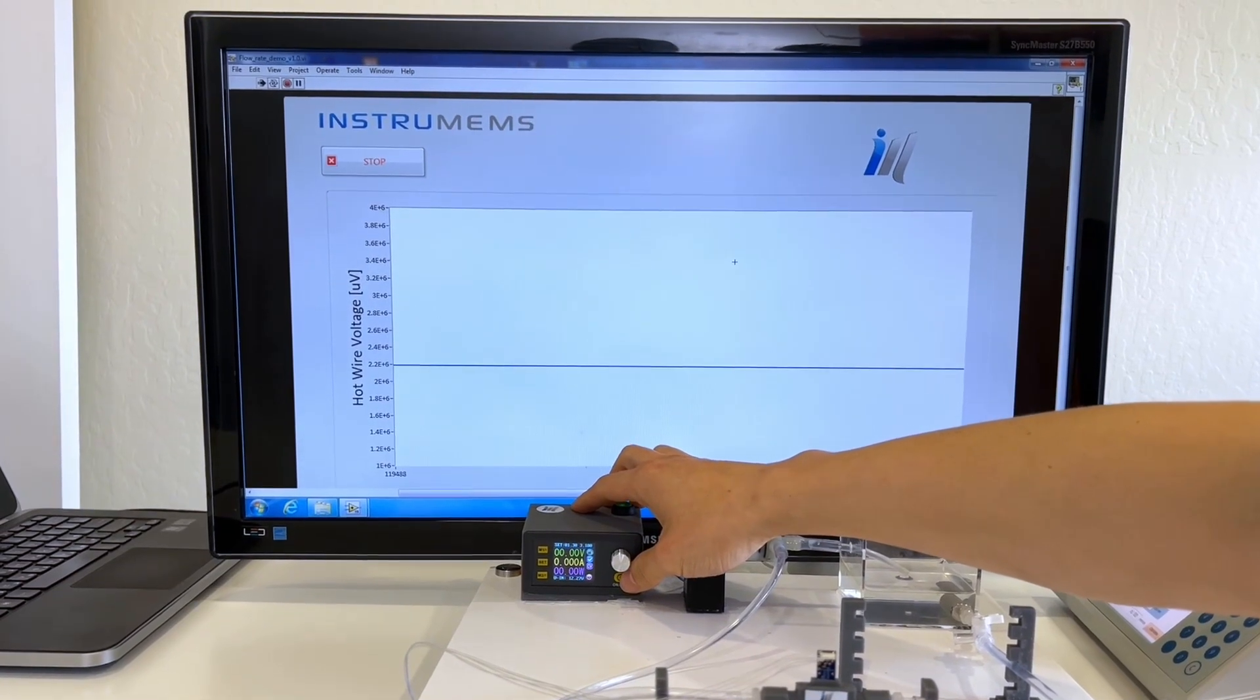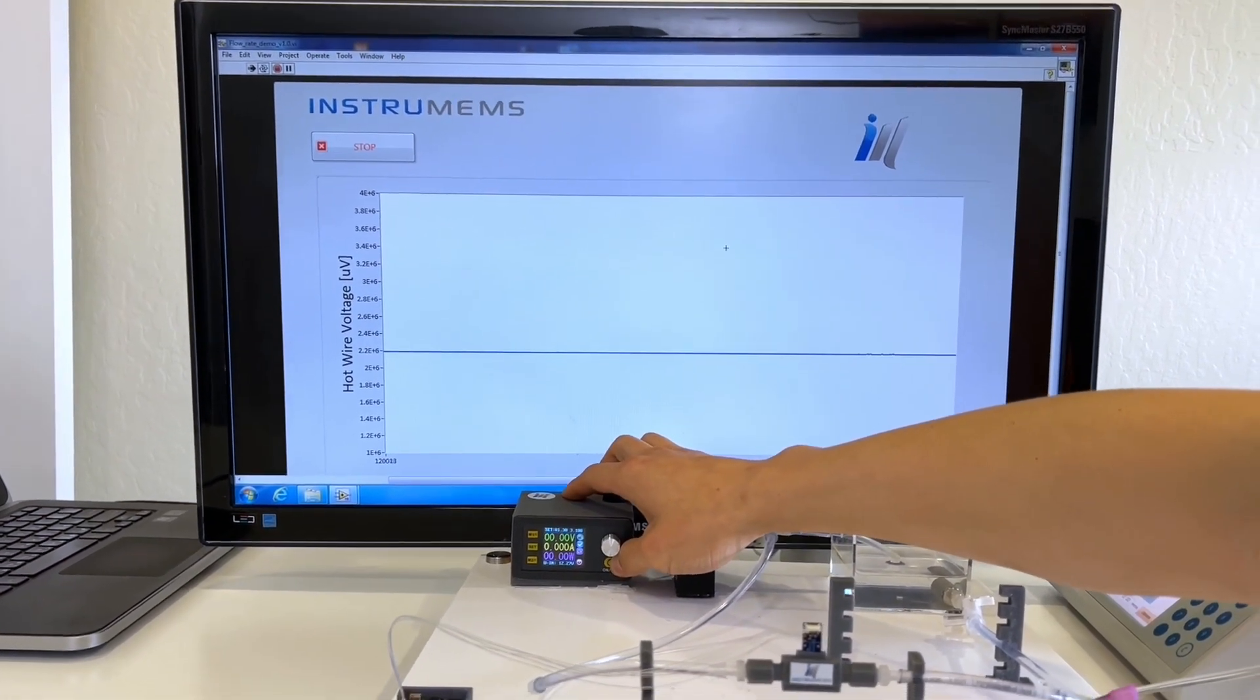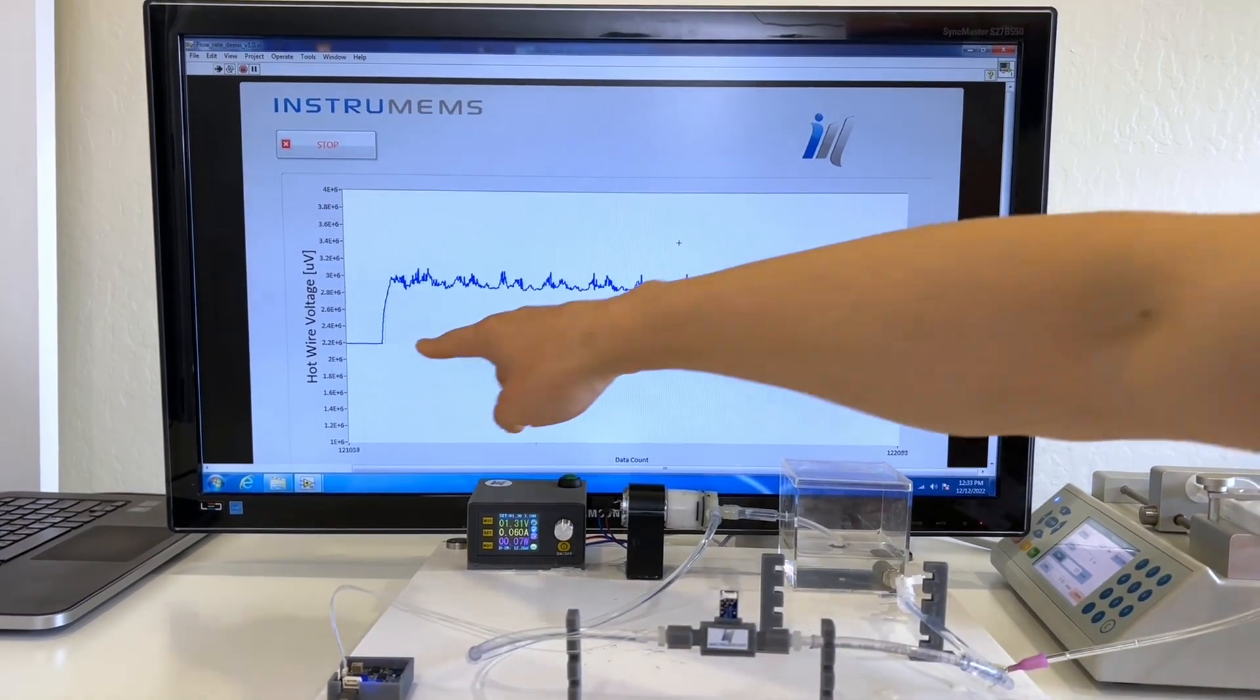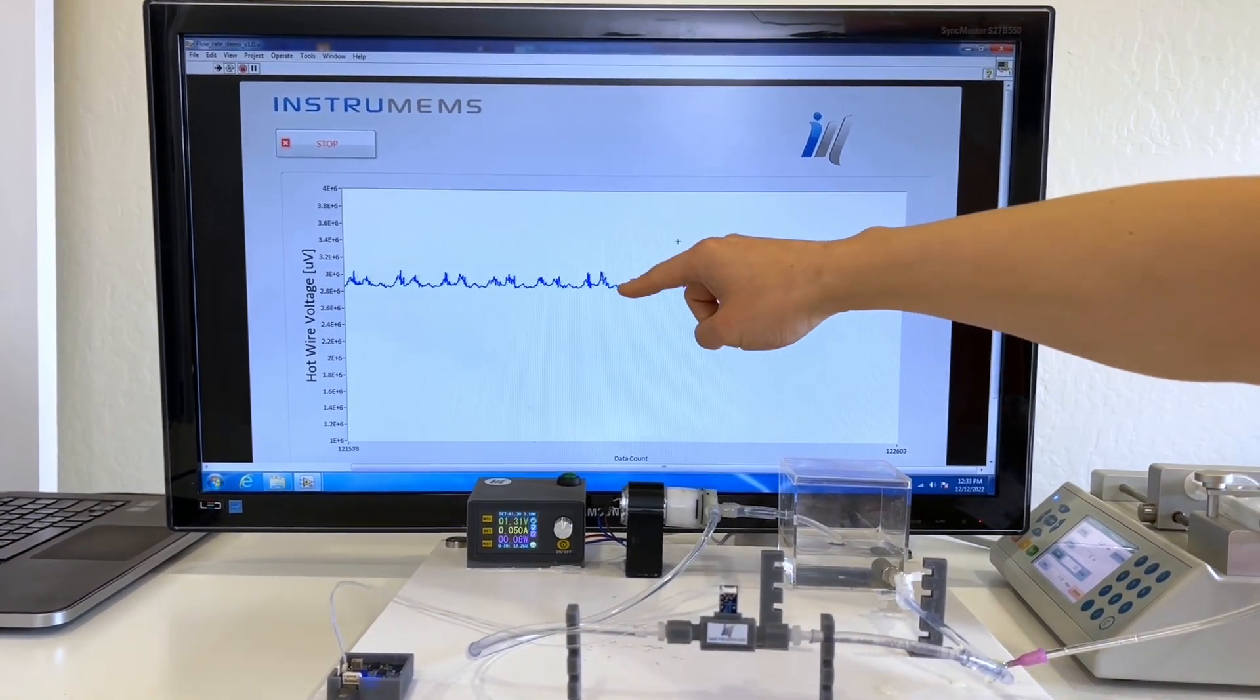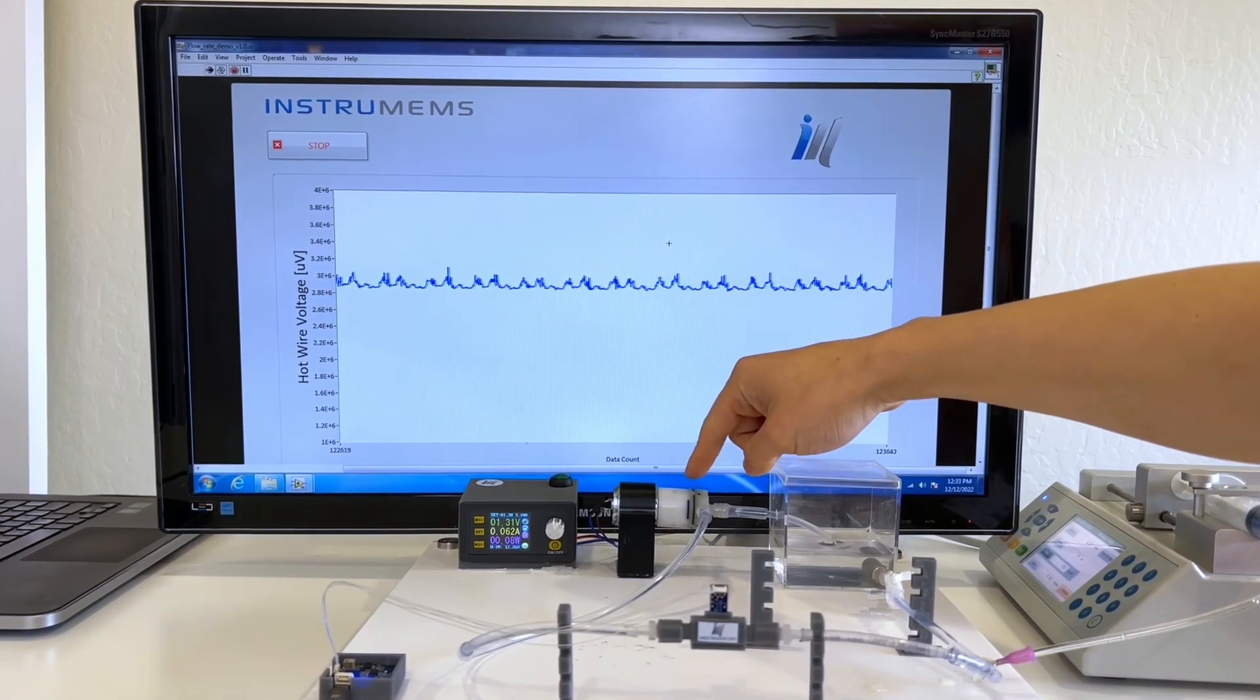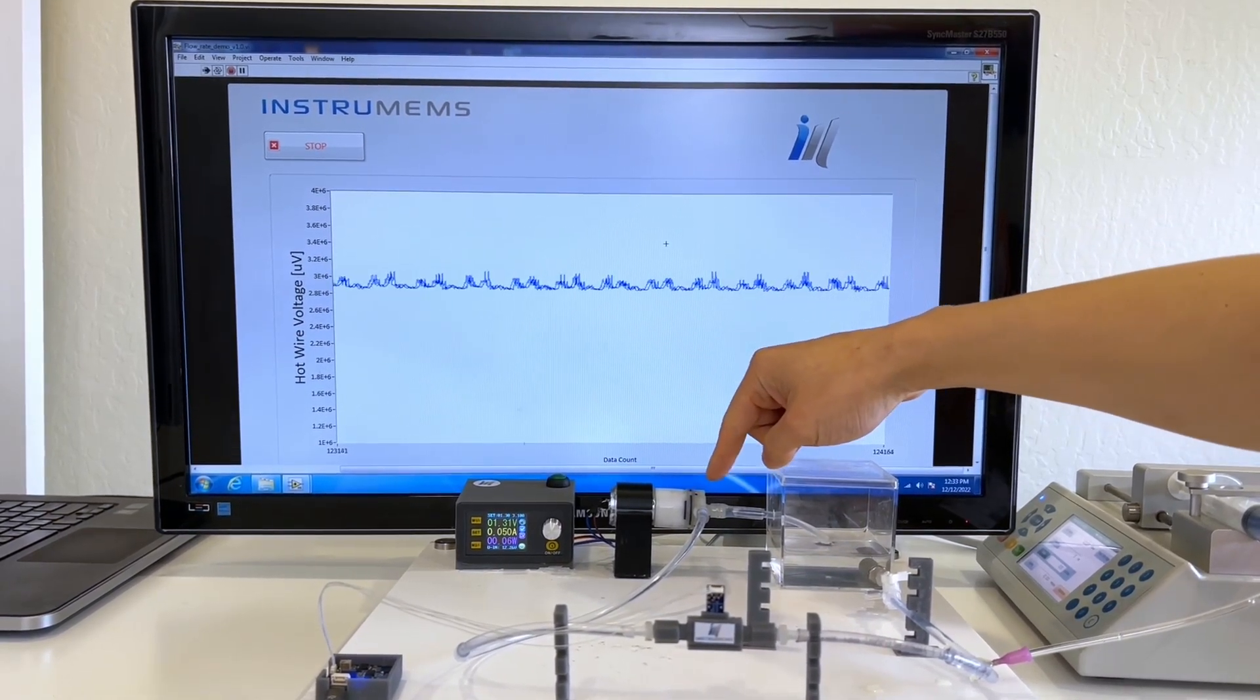Our first demo is the liquid flow measurement. Upon turning on the pump, the sensor's fast response time registers the flow instantaneously. The sensor also indicates the residual perturbations present in the flow generated by the pump.